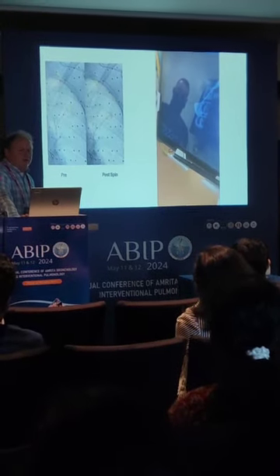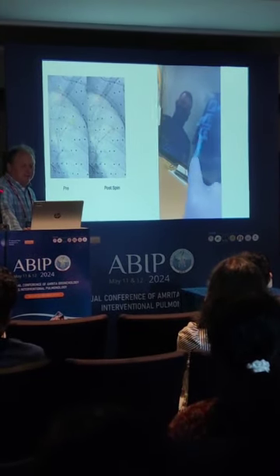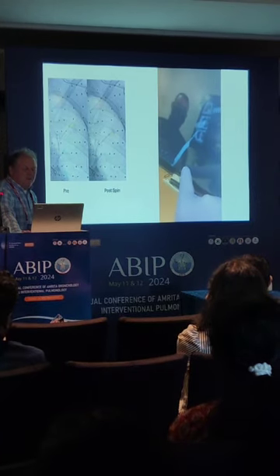Just using my iPhone to film it. That's Freddie in the background. He's come to see you. Proof that we're in the lesion again.